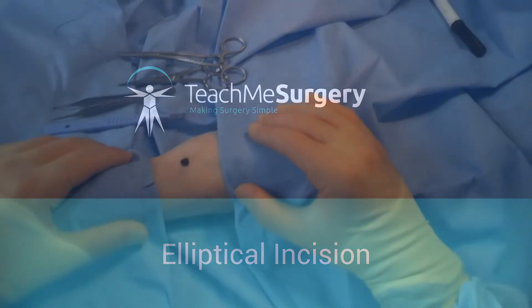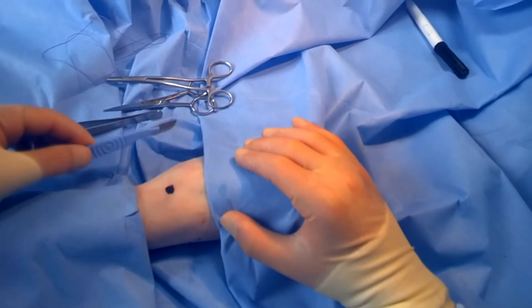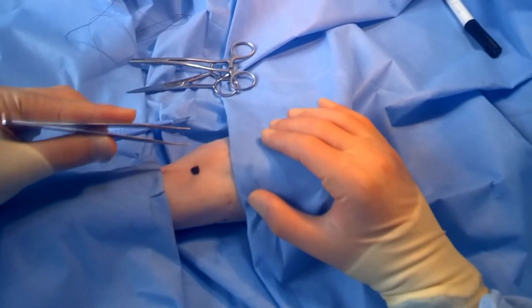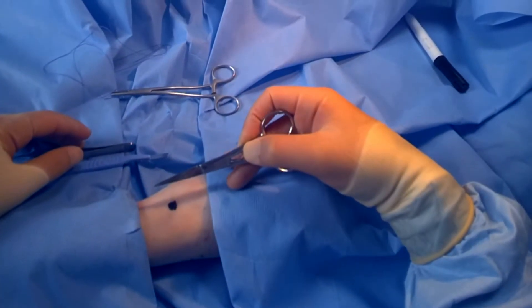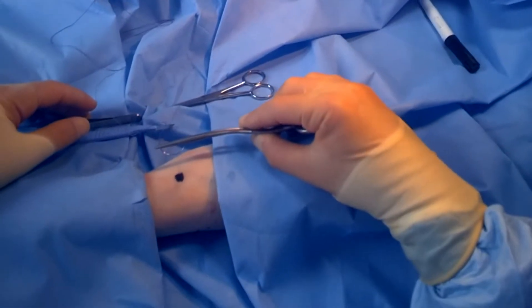In this video we're going to demonstrate the excision of a simple skin lesion. For this we require our scalpel, our toothed forceps, scissors, and our suture.